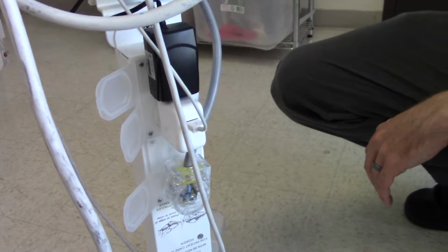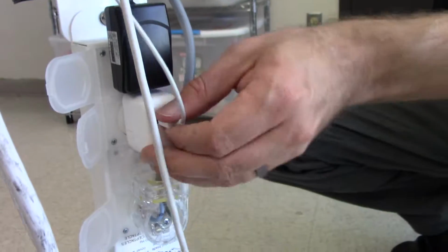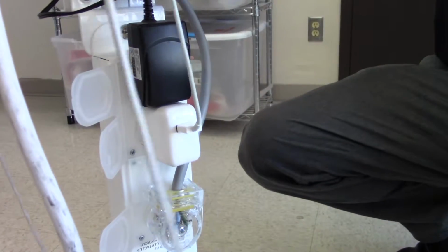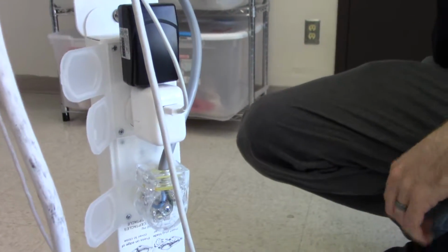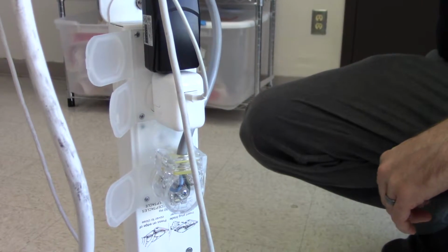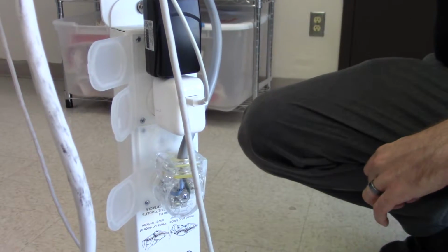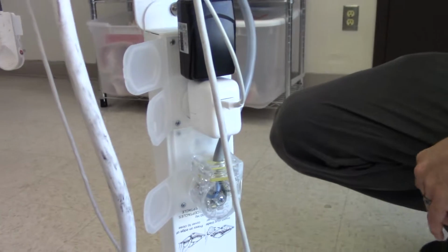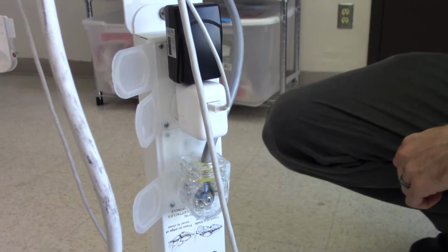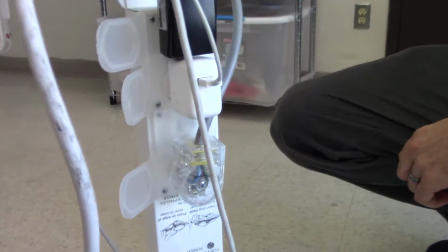Okay, so what's the worst part of the power unit? What are the biggest problems? It's just that it's exposed here. It falls out all the time. It gets loose, and the iPads don't charge. Okay, so it's not protected from impact, and once again, because of the way the cable's running. So if the Apple charger couldn't be stolen, and the cables, do the cables get worn out or broken because of the angle? Frequently. Okay, so if the cables were somehow more protected and the Apple charger couldn't be stolen, then that's the main problem with the power harness. That's correct.